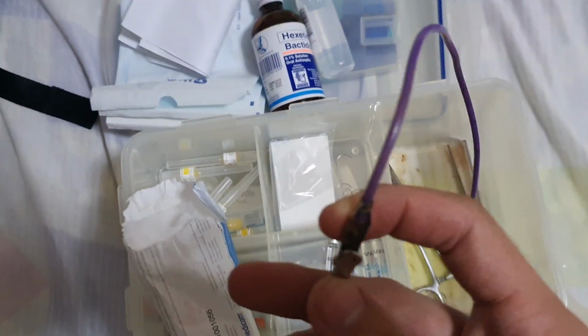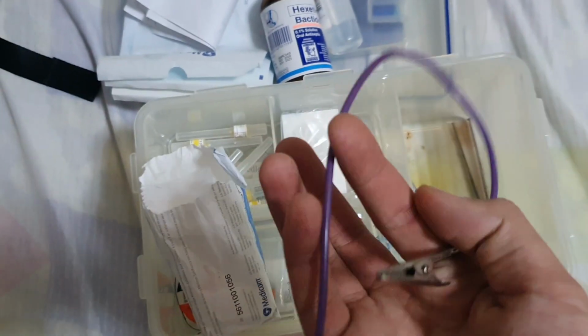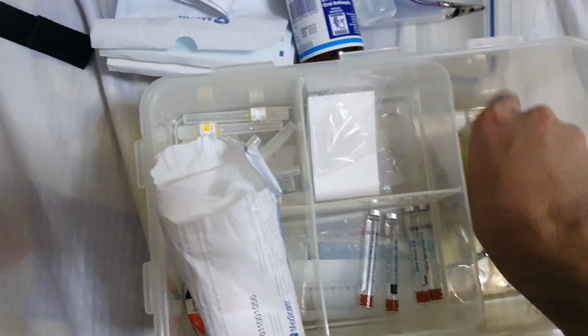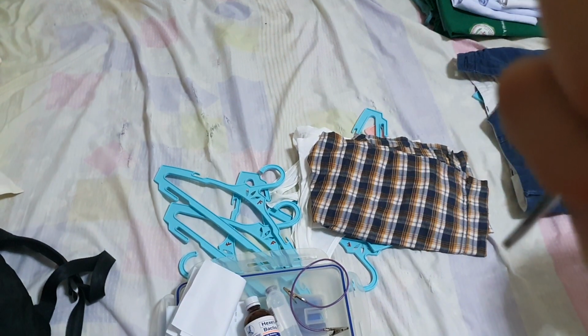And also the bib, very, very important. The bib is very important so that you keep the drape over your patient. And also the forceps.